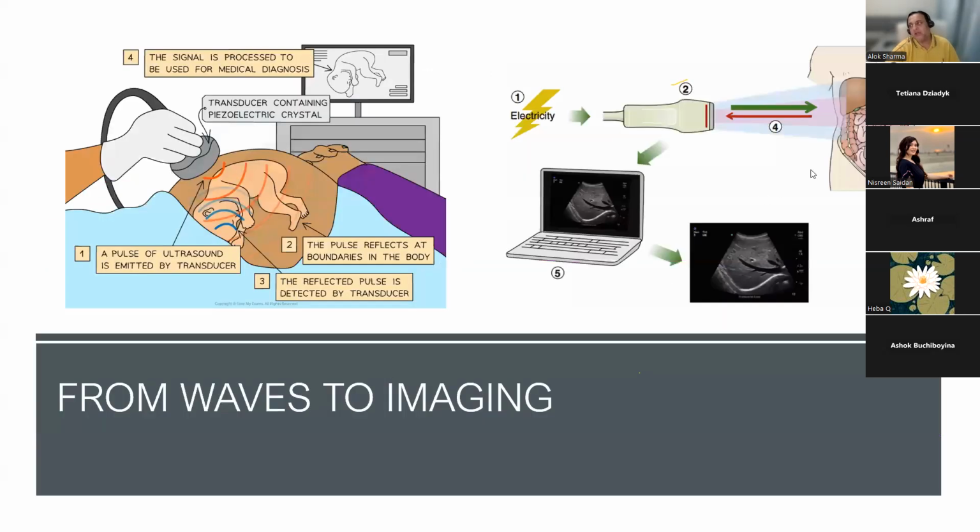What we also know is the tissue density changes. So if you look at just the bowel, and I'll talk to you about lung, the tissue in the colon is going to be much thicker than the thin-walled small bowel. In addition, if sound waves have to penetrate and interact with bowel by using the liver as a window, there's going to be a lot of reflection off the liver. So the normal velocity that sound waves would take through liver, because of its high density, will be very different to what it takes through bowel, which is full of fluid, where the lower density might allow faster propagation.